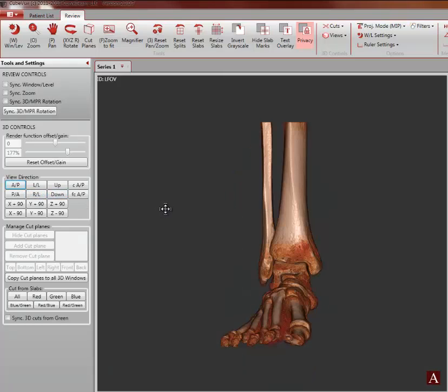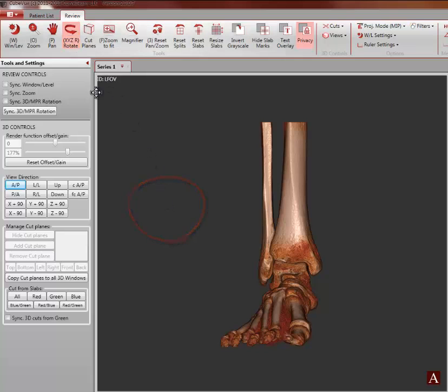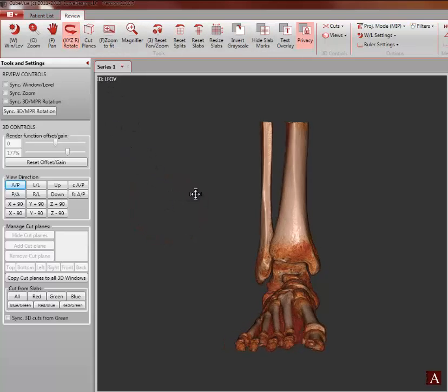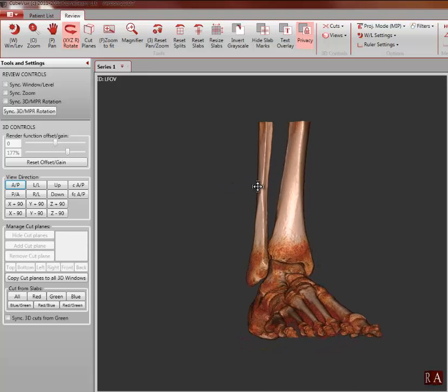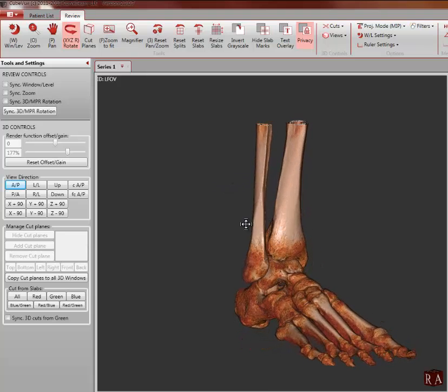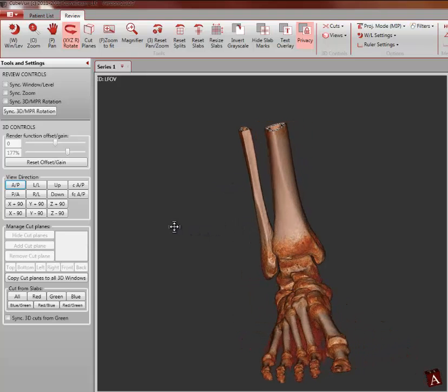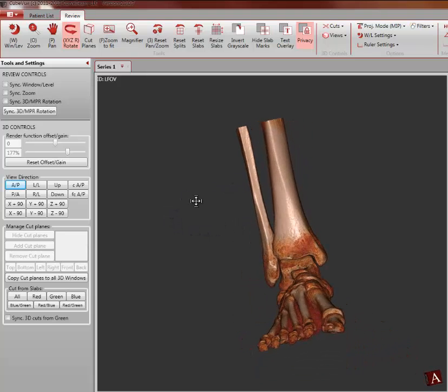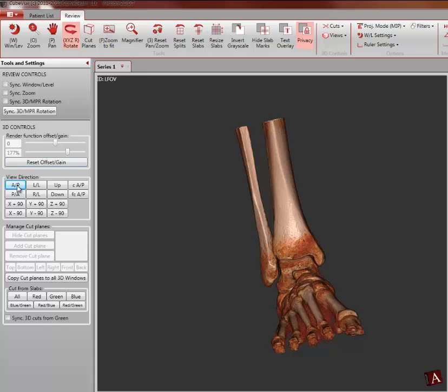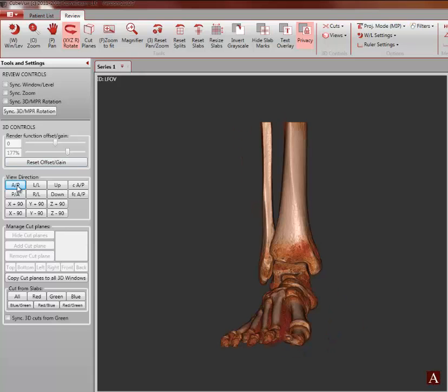For freehand rotation, the cursor must first be in this form. If not, click the rotate button on the main menu. Then you can drag the mouse in any direction to rotate the image.